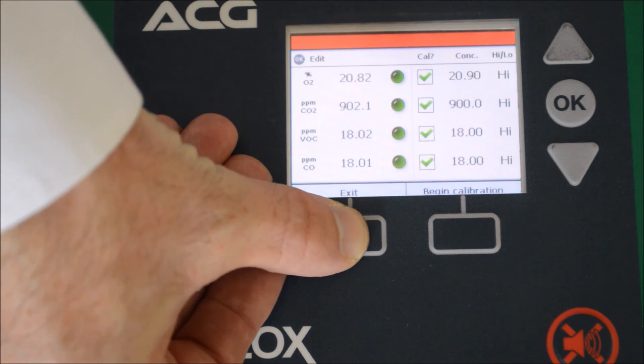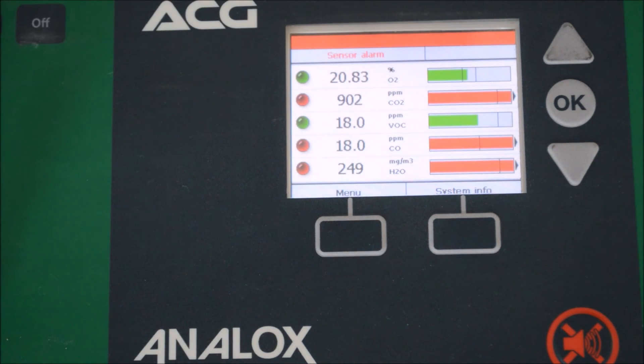To exit that menu, we now just press exit, and we'll go back to the main screens, and remove the calibration gas, and turn the unit to the off position.